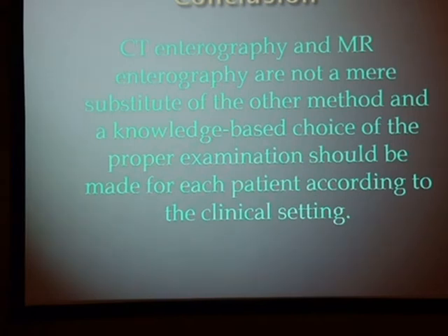Conclusion: CT enterography and MR enterography are not a mere substitute of each other, but a knowledge-based choice of the proper examination should be made for each patient according to the clinical setting. Thank you.